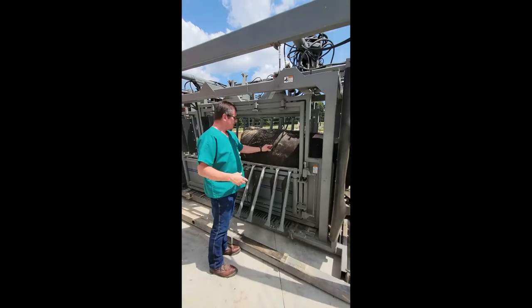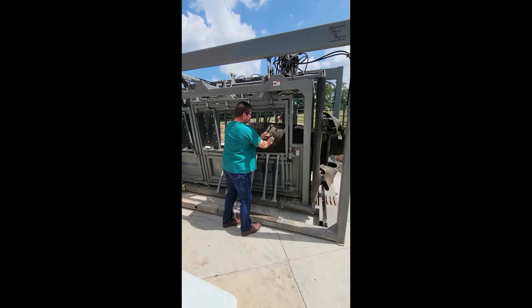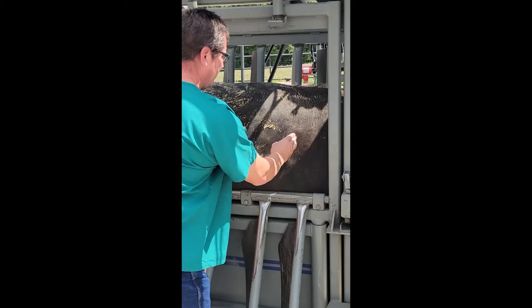To locate the 10th intercostal space, we count back from the 13th rib: 13, 12, 11, 10. So there would be the 10th intercostal space, and that's where we're going to go in.